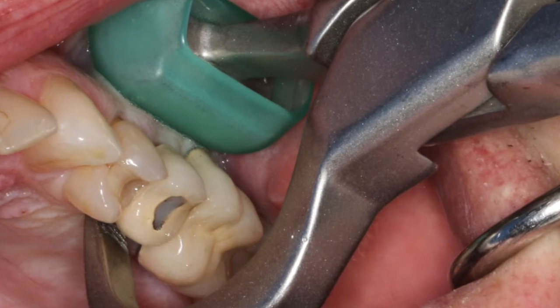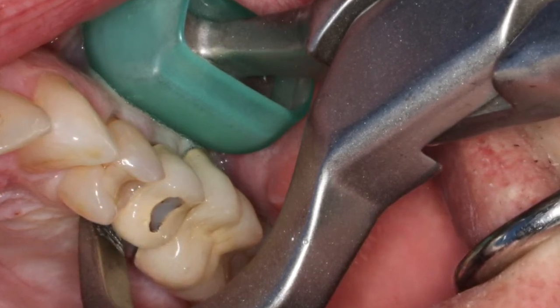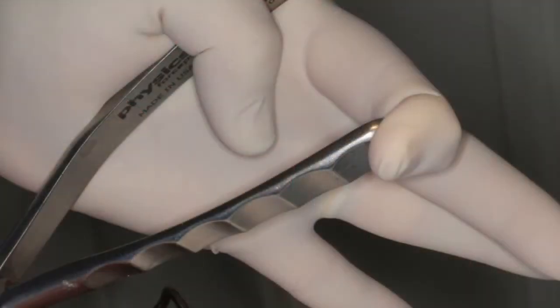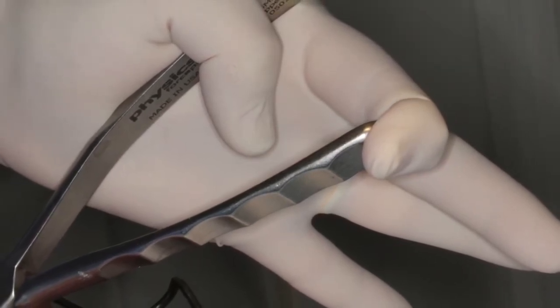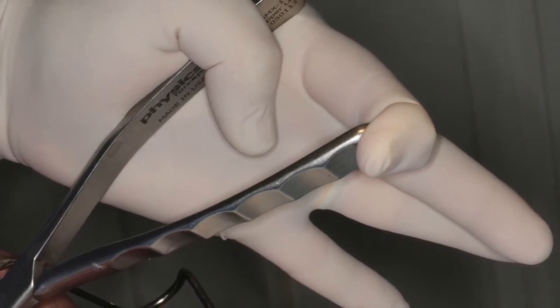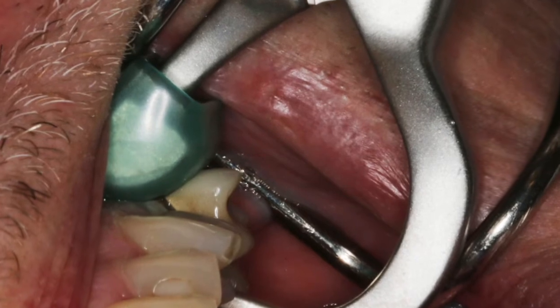The beak is engaging and placing tension on the palatal aspect of this root. That tension is going to create a physiologic response, which will create an enzyme which will break down the periodontal ligament. When the periodontal ligament is destroyed, the tooth will then disengage up and out of the socket.